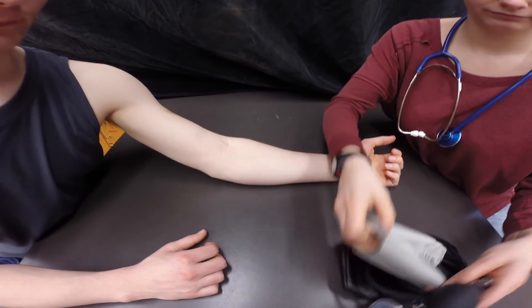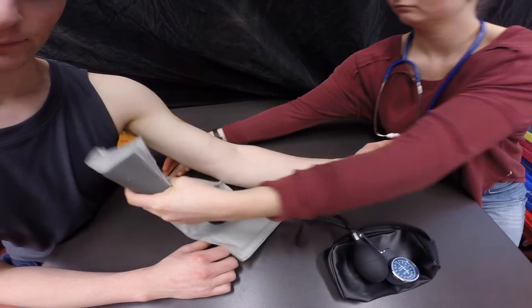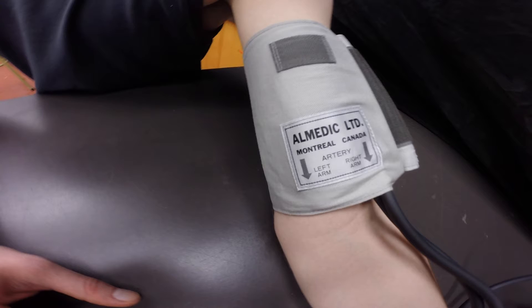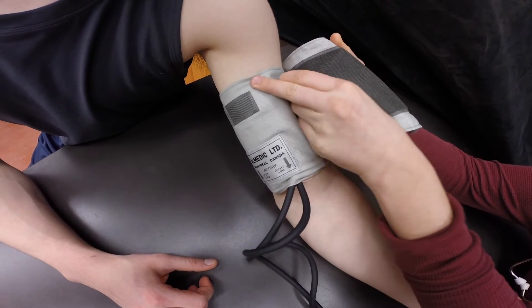Now place the blood pressure cuff on their arm about 2-3 cm above the elbow. Ensure that the arrows on the cuff align with where you felt the brachial pulse. It should be snug enough to fit two fingers underneath.